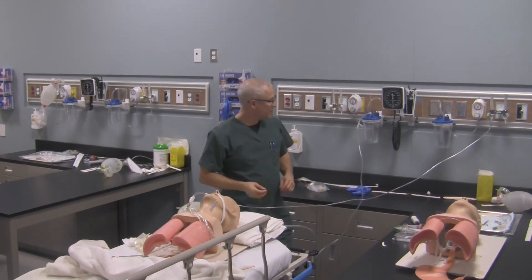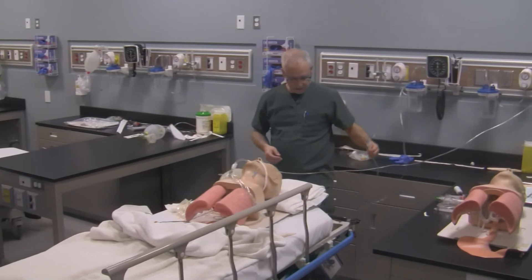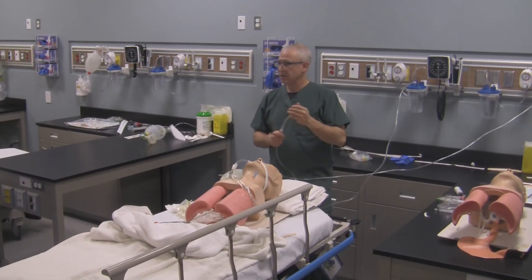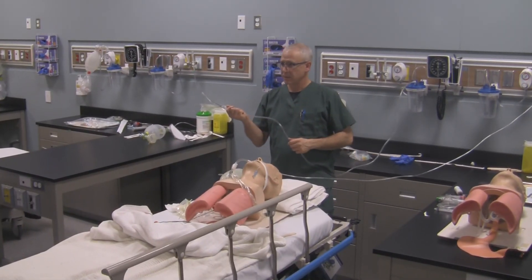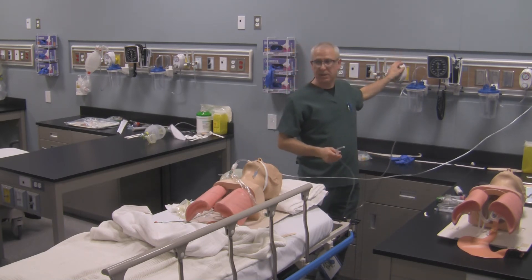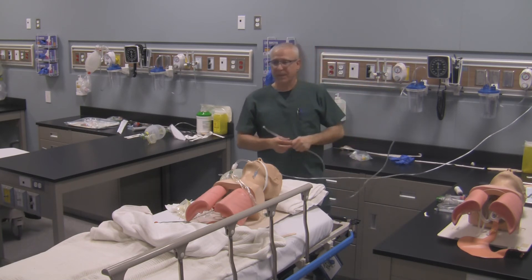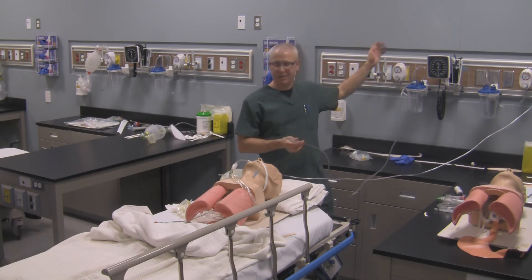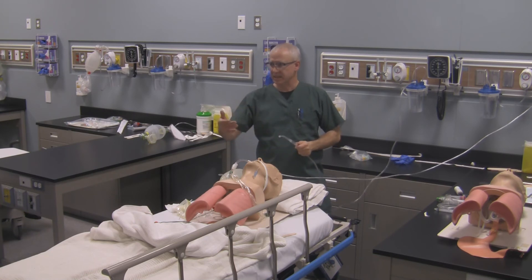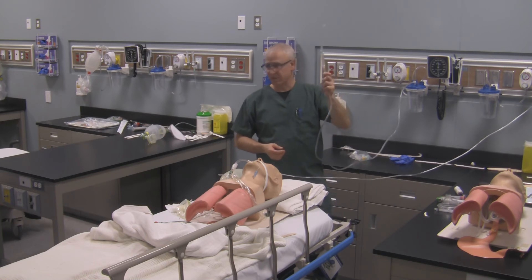One thing you might have noticed is that when I put the suction catheter in, I never shut the suction off. Try not to get into the habit of suctioning orally and then shutting the suction device off — because you're just potentially taking extra seconds to get the patient suctioned, and they might require suctioning immediately. So always keep the suction running.